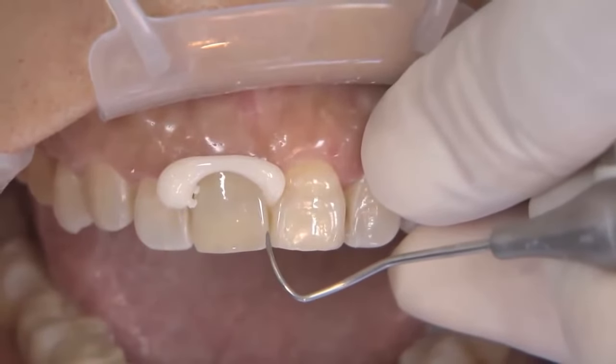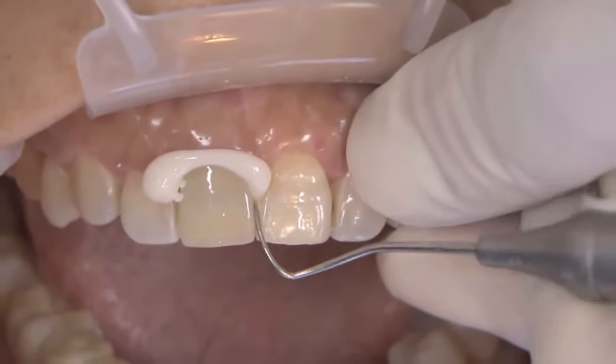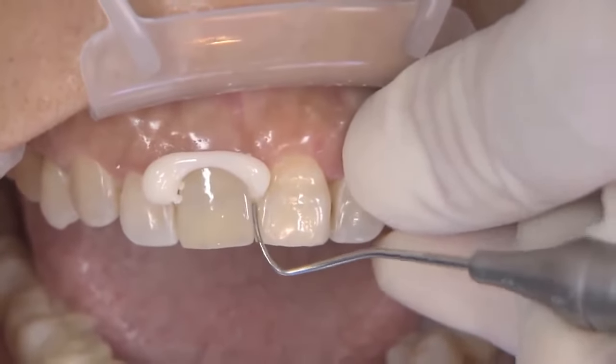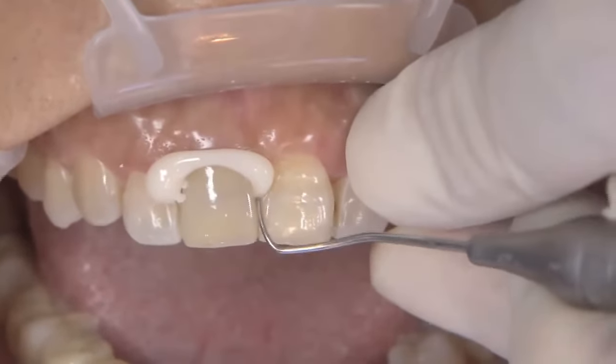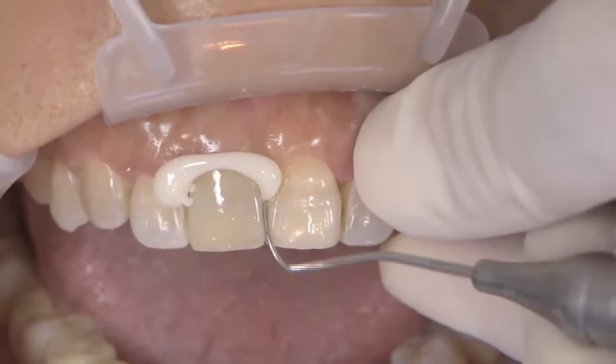It's a nice feeling to be able to go in and really slide your explorer underneath it and peel that away — and really feel like, wow, not only did I get all the cement off, but it was simple and straightforward. It was not difficult to get off.